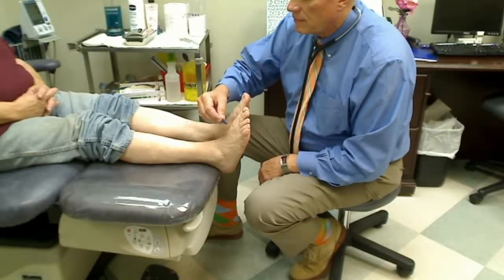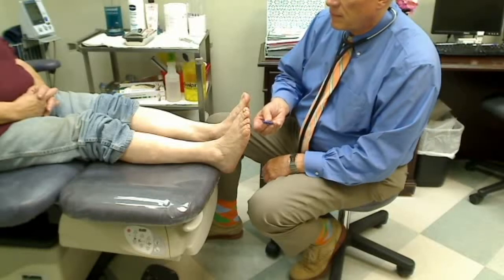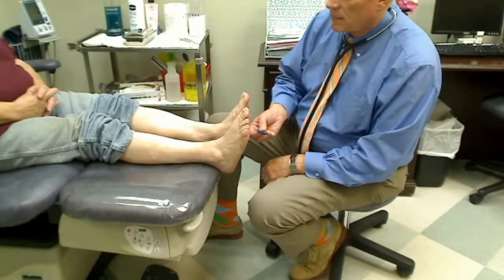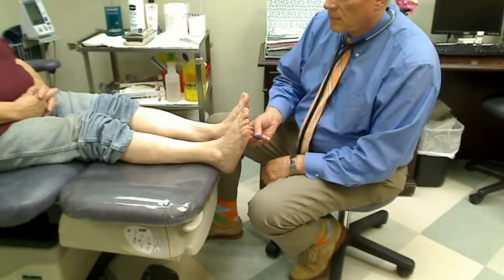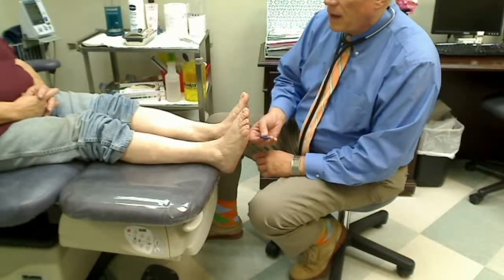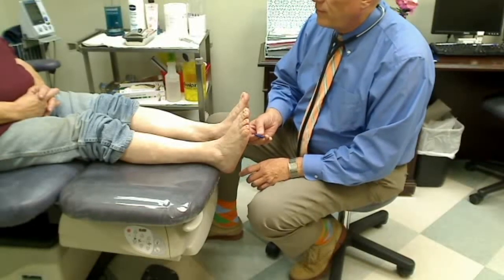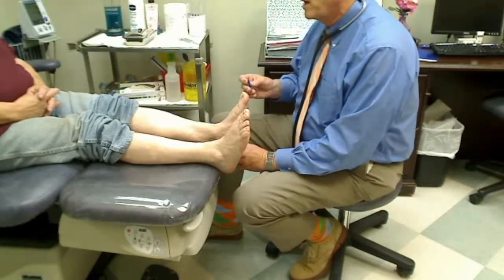Yes. Yes. Now also I want to apply just enough pressure to make the monofilament form a C. That's what we do. We'll check the other foot the same way.